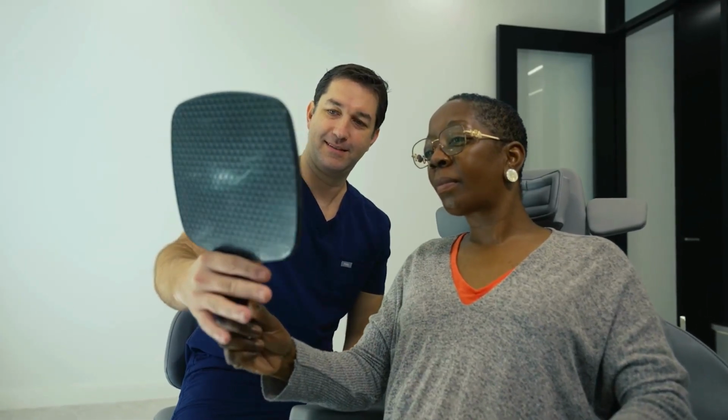Another procedure where the microscope can help me get good results is when patients have infection around dental implants, where it is very difficult to achieve a good cleaning on the implant, on the metal. But by using the microscope, I can see 8 to 10 times bigger than the natural view. That allows me to clean the implant a lot better, which increases the chance to stop the infection and have a much better result in cases where patients are having bone loss around the implants.